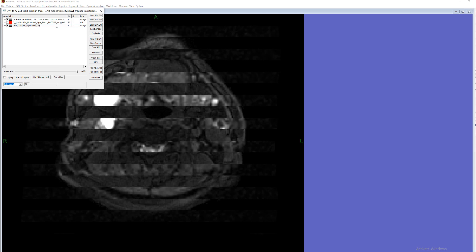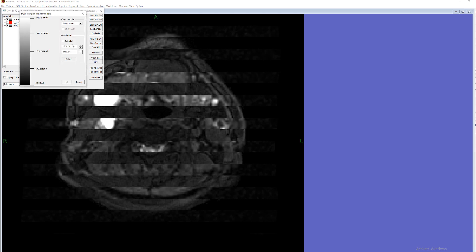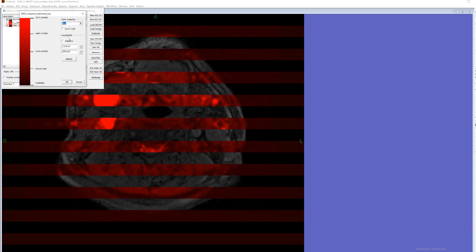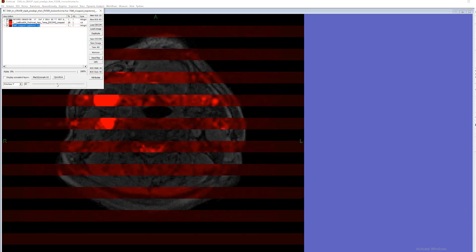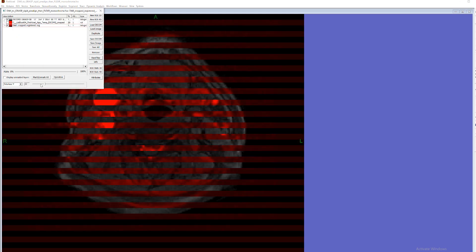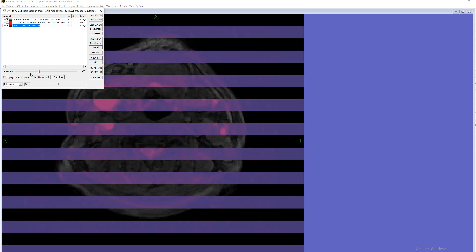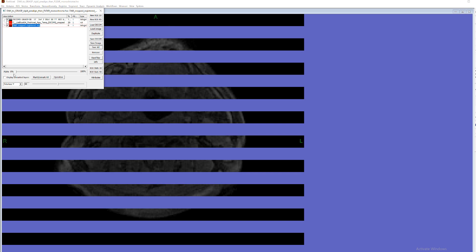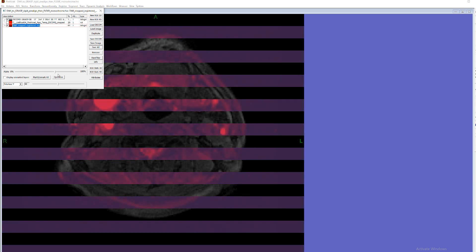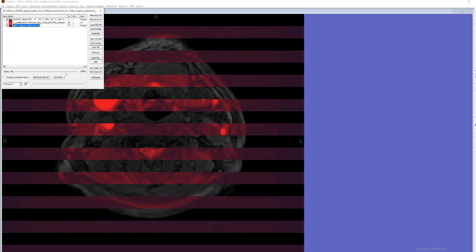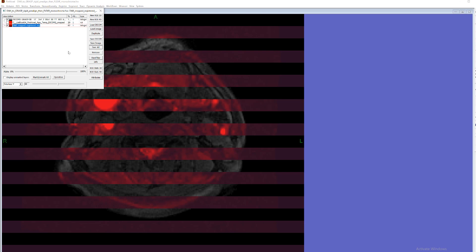So in this mode we still can use all the usual operations. Like for example change it to different colors. And the intensities are still working. For example we could change alpha. So yeah interlacing works well with all the other options. And again interlacing is specific for the entire document. So thank you very much.